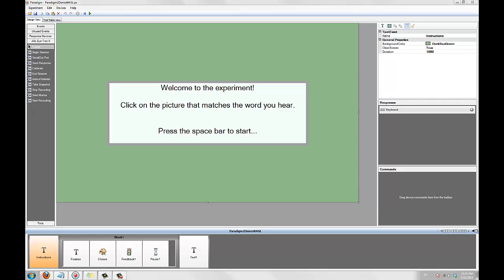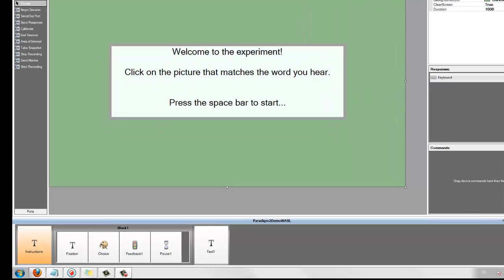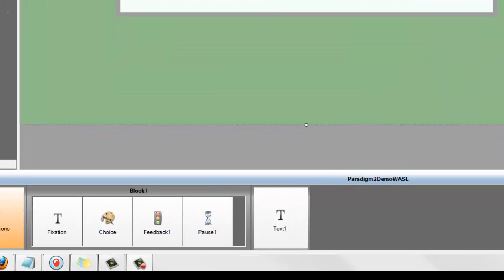Now that we have our port enabled, let's add the first ASL element, the begin session element. Begin session is typically added to the experiments command area, which you can access by clicking on top of the event sequence.